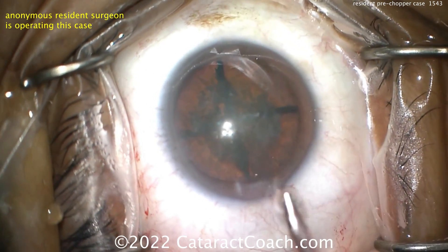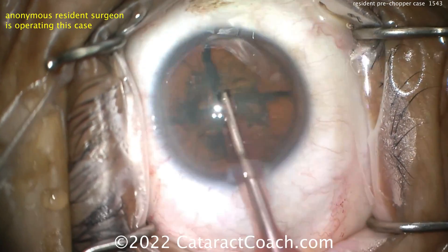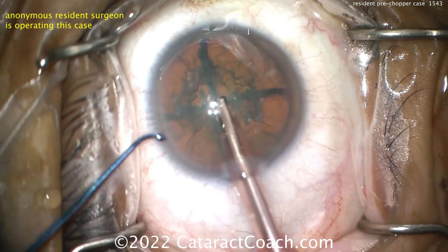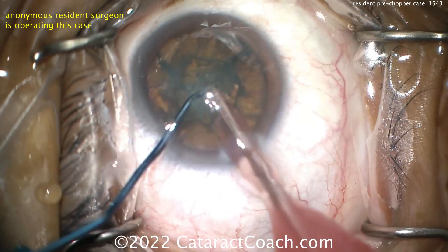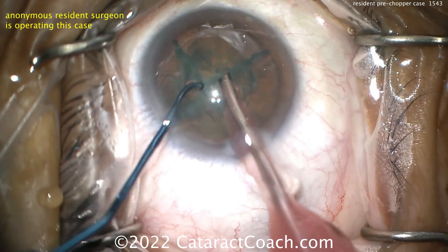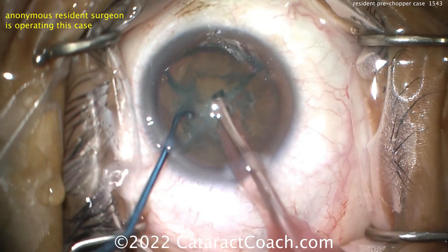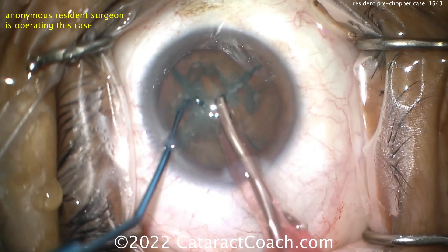You can put a little more viscoelastic in to separate the lines. Now going in with the phaco probe — at this point you need high vacuum, 400 or more millimeters of mercury. Using a blunt chip-tip chopper to make sure the quadrants are fully separated. Tip up that piece, grab it right at the apex, bring it centrally, and you should be able to aspirate it all pretty well.